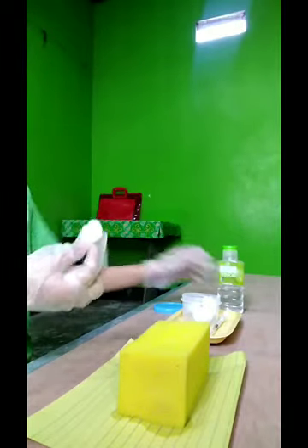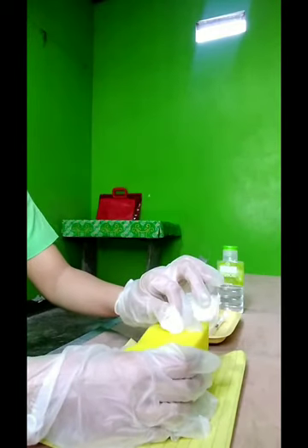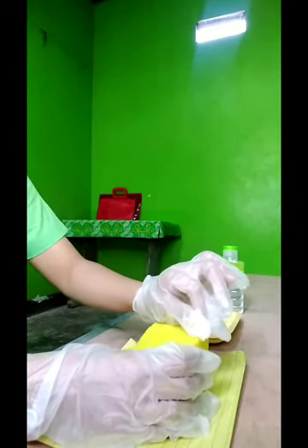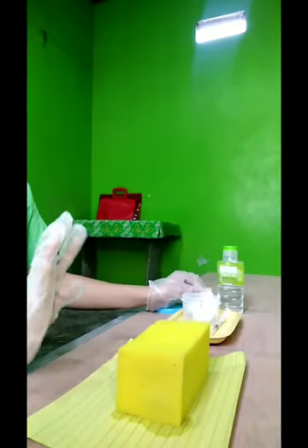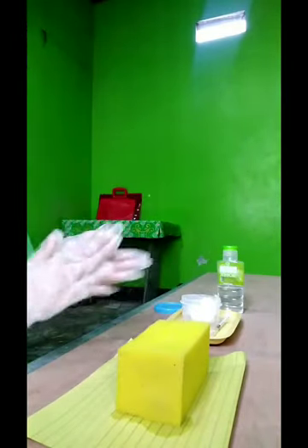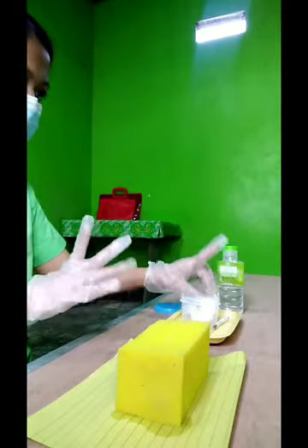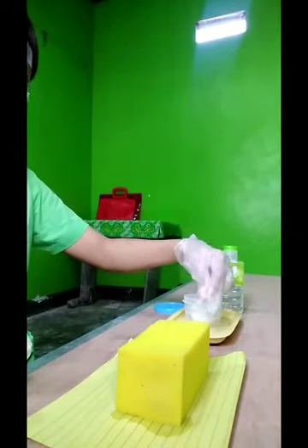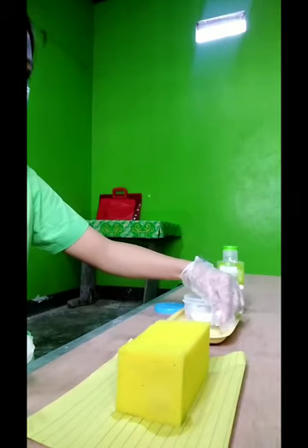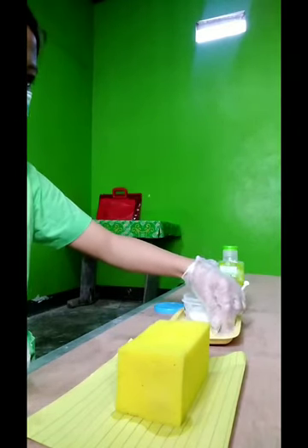While wiping with a firm, circular motion and moving outward from the injection site. Then, allow the skin to dry. Then, remove the needle cap with the non-dominant hand by pulling it straight off.